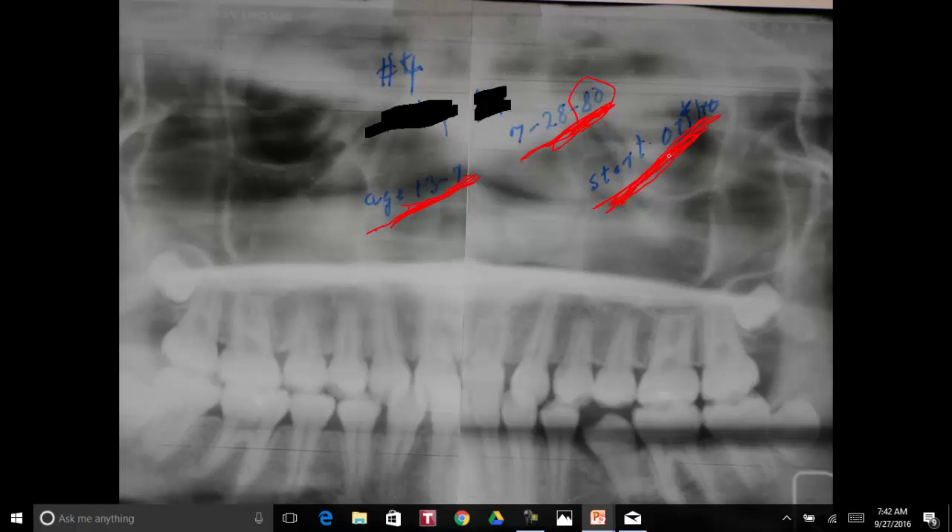There's really not a whole lot to do to it at this point. Now we do have to come in and shape these teeth. You try shaping them up really good and you can make them look so much like laterals you just can hardly tell the difference. And if both laterals are actually cuspids, they look good — you don't draw attention. But if you've got a small regular lateral here and a pretty hefty cuspid lateral here, they draw attention to that. So sometimes we sacrifice a fairly good lateral to make the thing look good.